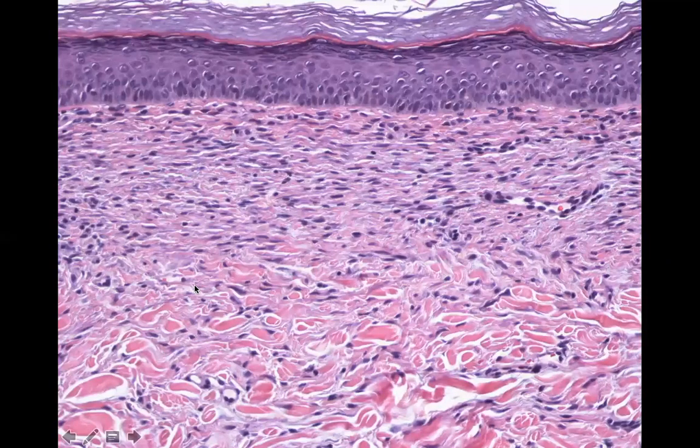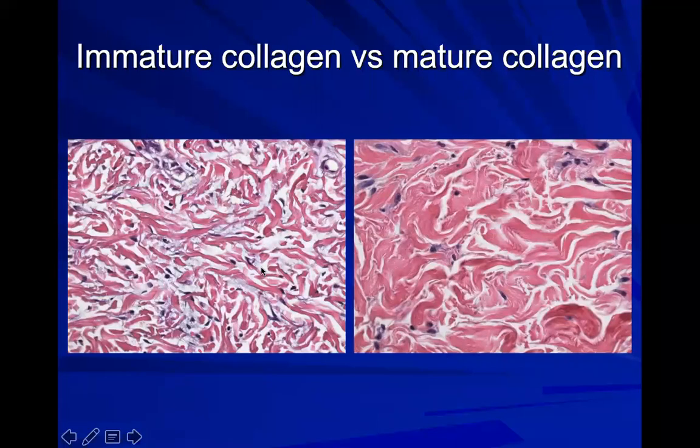Okay, so this is early scar formation. You see the collagen, rather than being ropey and twisty, it's kind of oriented. And these are all fibroblasts, and they're laying fresh collagen, and it's more blue when it lays fresh collagen. And you can see it's a relative increased number. Immature collagen is blue. You bring a lot of your extracellular matrix that's going to show up as mucin when you build collagen, and when it thickens, it's more red because that goes away.